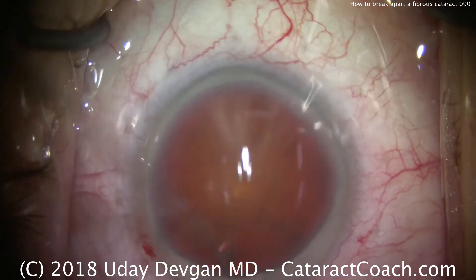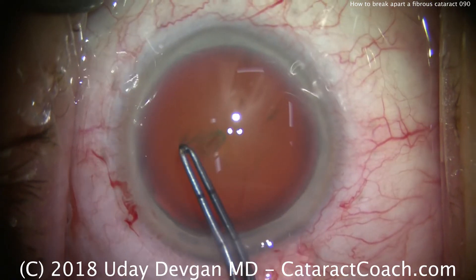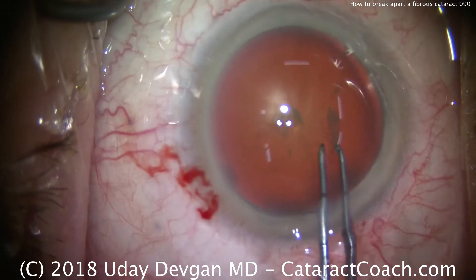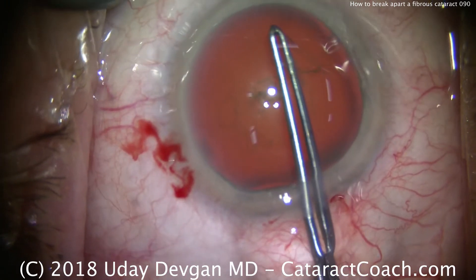We're going to make our capsulorrhexis. It's important to have an appropriately sized capsulorrhexis. I just did a mental measurement with the forceps — those forceps, as you can tell, have marks on them. So I hold that at the beginning to give myself an idea of how big I want to make the rexis.